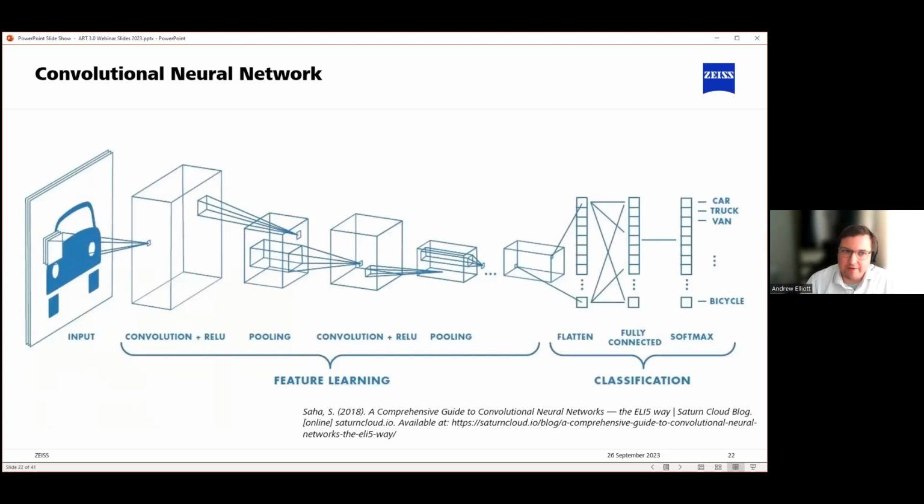So this is a very basic look at what a convolutional neural network is. This is the type of network that Deep Recon uses. This is not the be all and end all. There's a lot that I won't have been told about the inner workings of Deep Recon, but this will help give you a general idea of how this works.